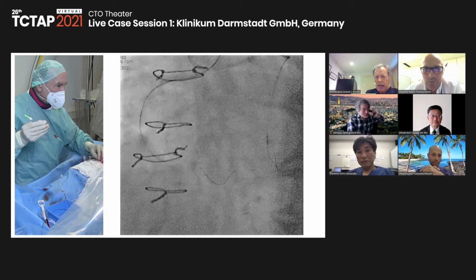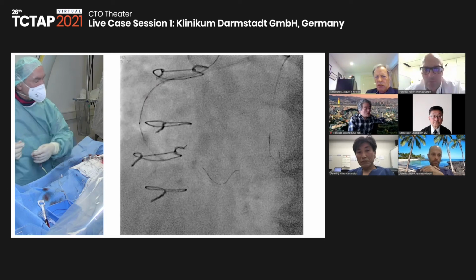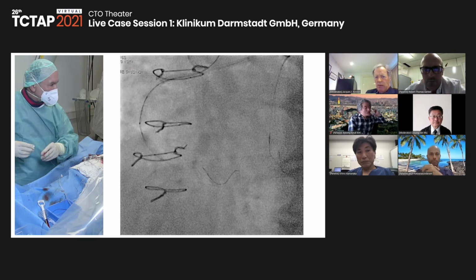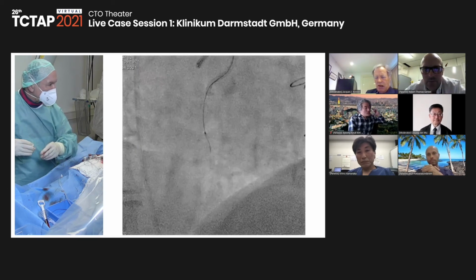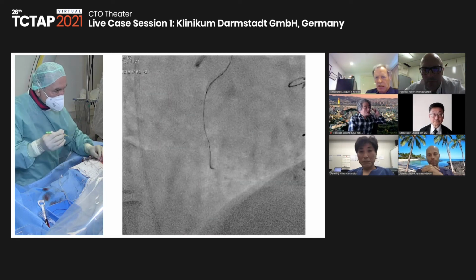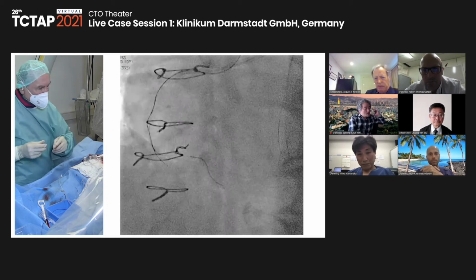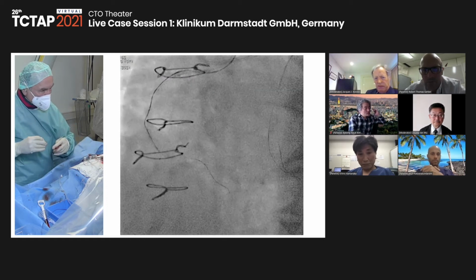Yeah. On the other hand, I have to say, Gerald, it was a good point you made there when switching directly to the retrograde approach when you got stuck with the antegrade. So that was, I think, a good educational moment. Now you have to repeat it. So. Yeah, but I think it seems to work here.